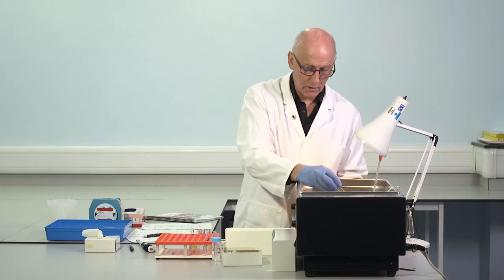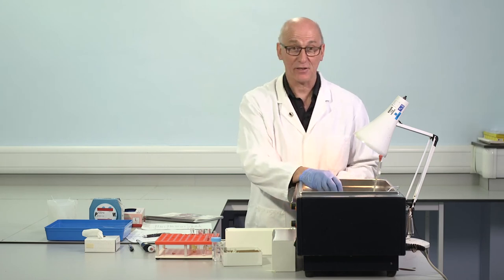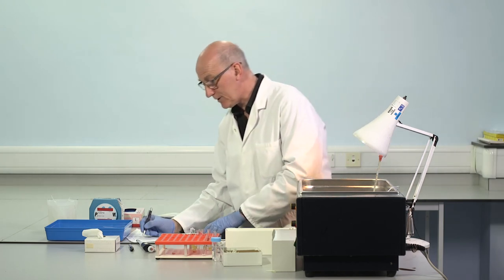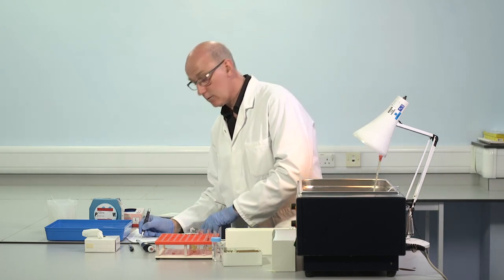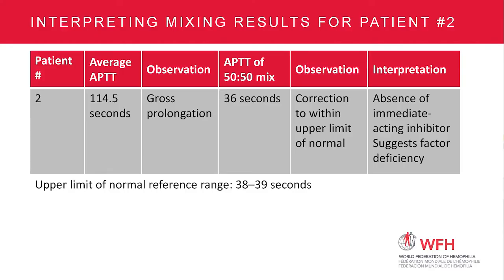So you can see the clots have gone. 36 seconds, 36 and a half. So that's a pretty substantial correction. Once again, same as the previous sample, it's corrected inside the reference range from a really, really gross prolongation. That's very likely to be a deficiency.